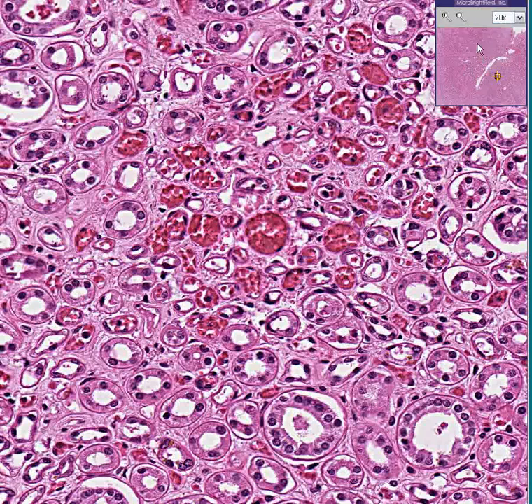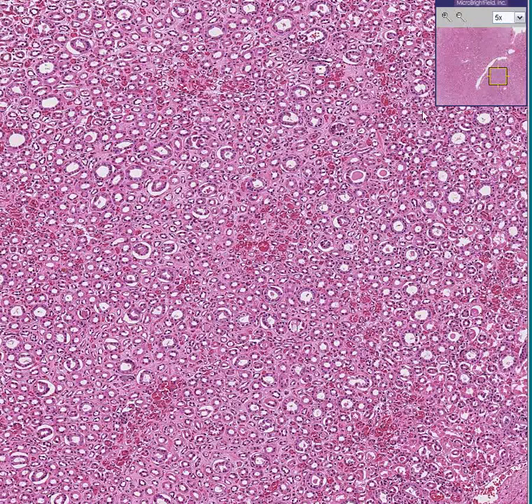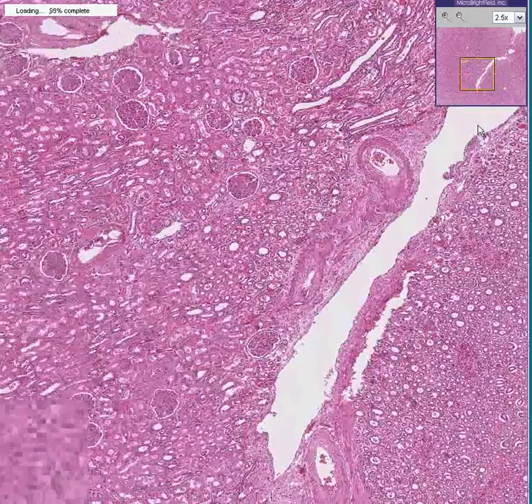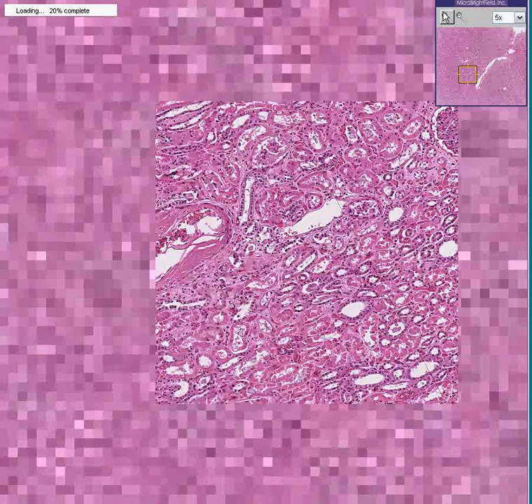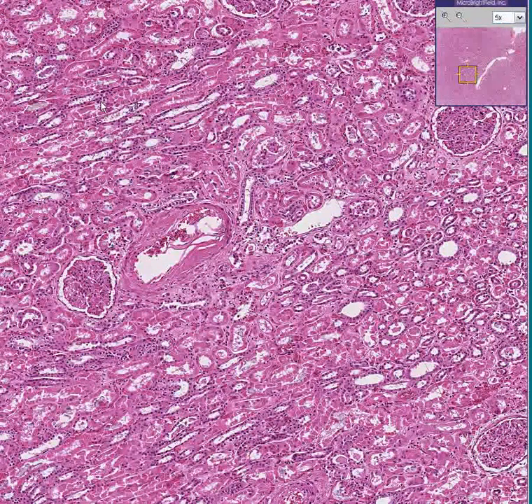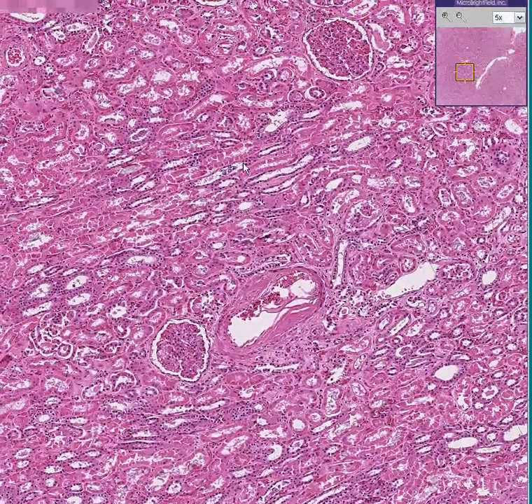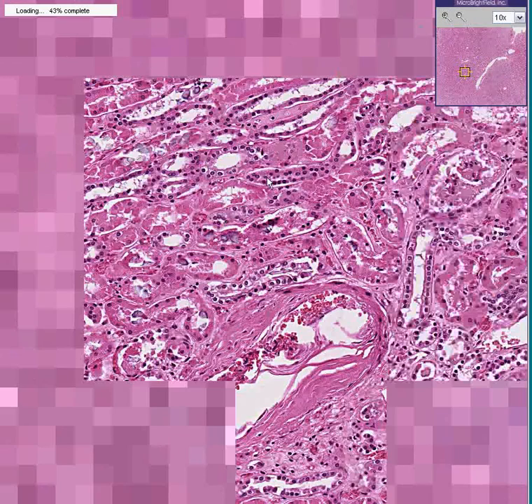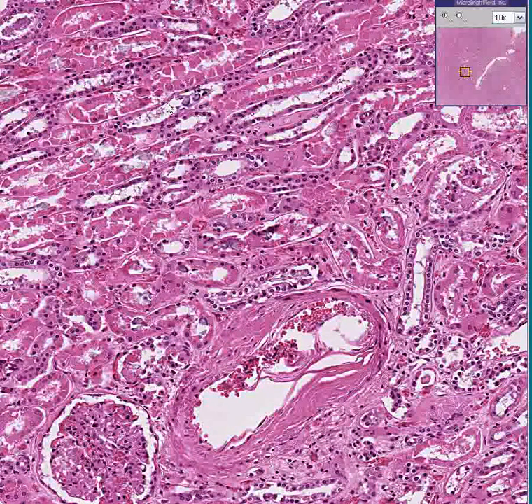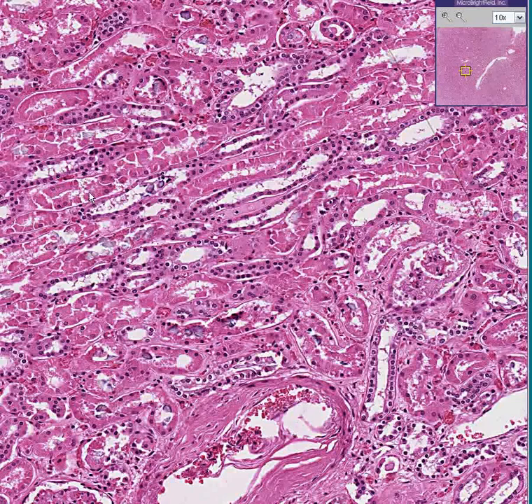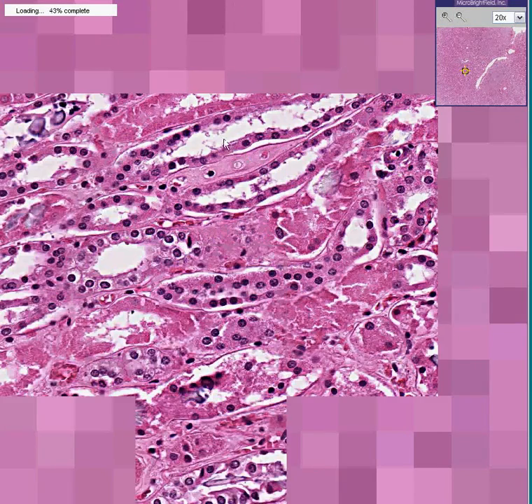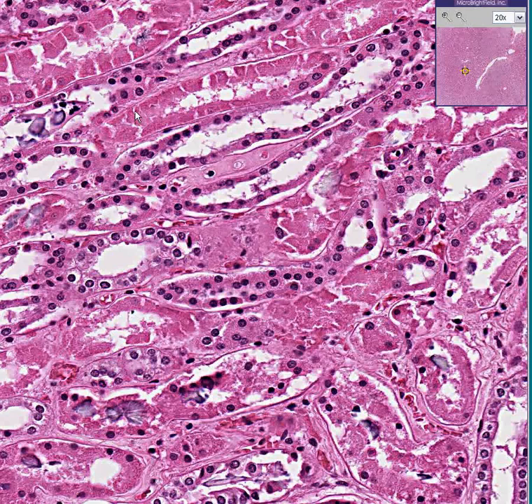This is not blood — it doesn't look like blood, but it's about as red as blood. These are necrotic individual tubules. Now that you know they're all over the place throughout the medulla, you might go out to the cortex where you see a good number of glomeruli as well. Looking at some of those tubules, even at this power, you really can't discern nuclei in them.